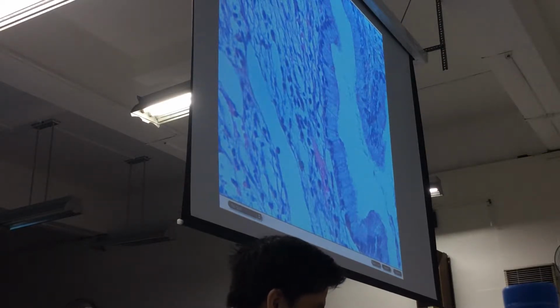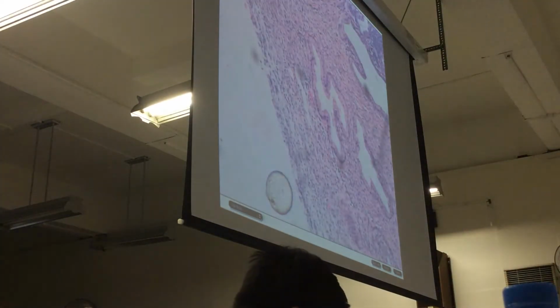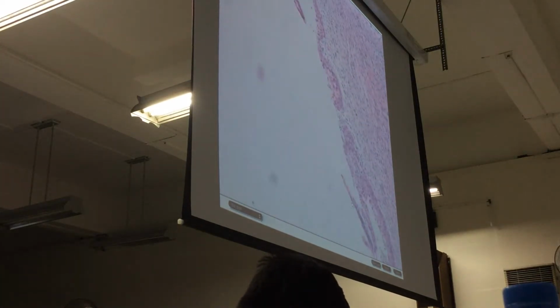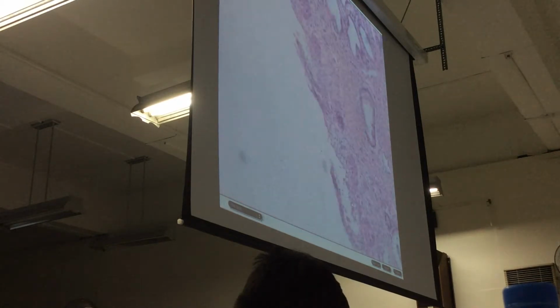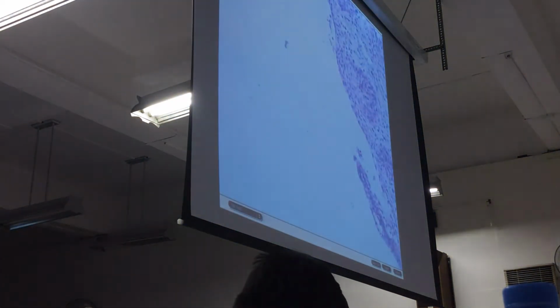Okay. That is the normal lining, as focused on the screen, of endocervical crypts and the endocervix. They're like the lining of what you reviewed a while ago in mucinous cyst and mucinous cystadenoma, correct? If you have an abnormal stimulus such as uterine prolapse or repeated infection in that area, the endocervical lining epithelium will be so irritated it will decide on another course.